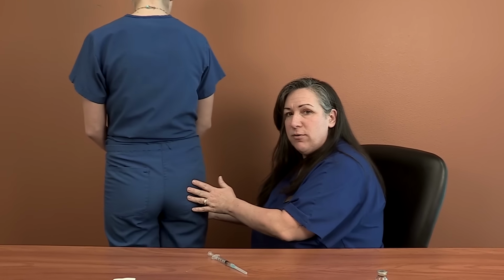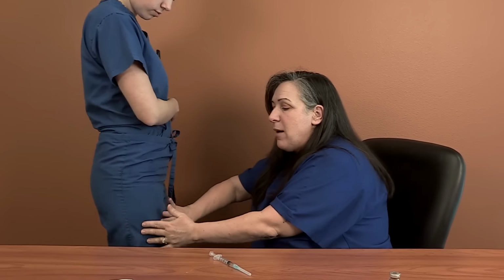Now, you can do it, and I'm going to have my little model turn around here for a minute. You can do it in your upper thigh. This is all muscle right here too. And a lot of gals who are stuck doing the injections themselves will ask me, can I just do it here? Well, you can, sure. And usually I would just have you use maybe a 1-inch needle because there's not as much tissue here generally between here and the muscle. But I will tell you, this hurts a lot more.